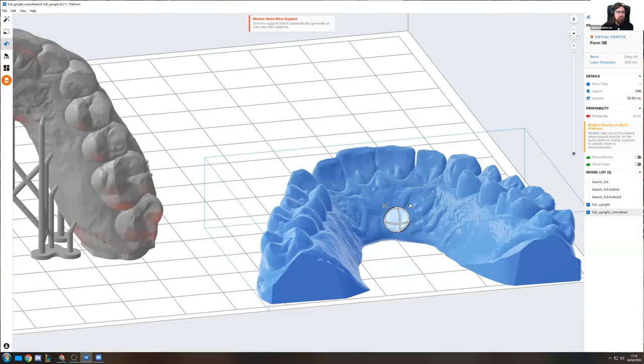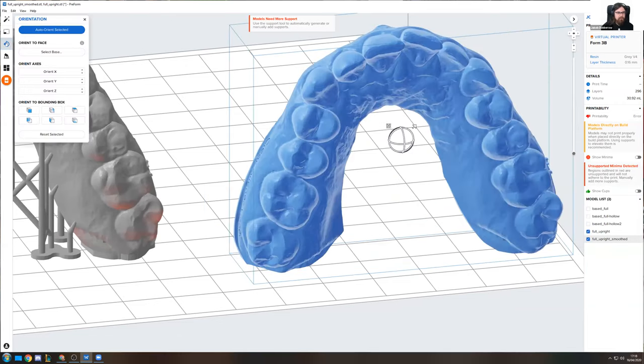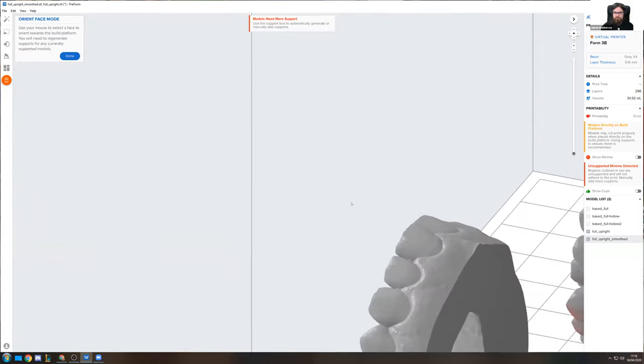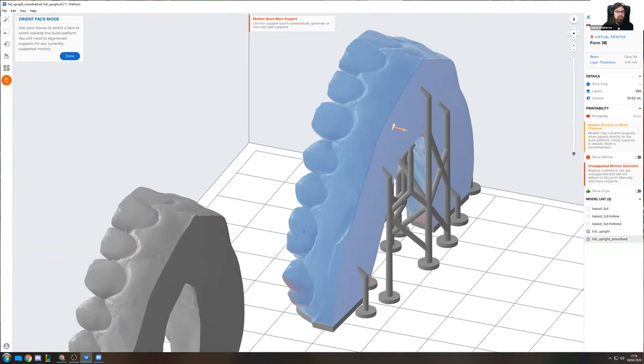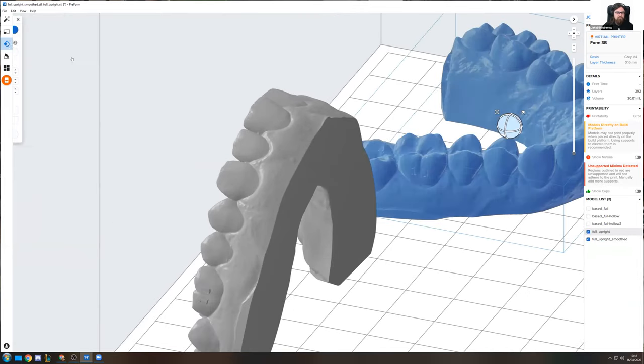So if we do it right now and put it on the back side again, I went over to the orientation tool and I used the select base feature. If you do that, your mouse becomes this little plane with an orthogonal on it. And then you can just click on any planar surface and have it be flat on the build platform. So that is a very, very useful function.